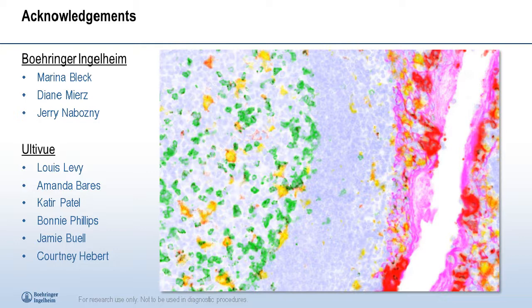Great, thank you, Alex. Here's a slightly more specific question. They say, would this technology allow us to identify dim versus bright expression of T cell activation? Absolutely. So you saw in a couple of the images there was PD-1 levels were very low or very high, and the CD45RO also had this beautiful dynamic range in T cell compartment. And using the halo image analysis, we were able to separate those two up. I didn't present that today, but that's something that is quite feasible.